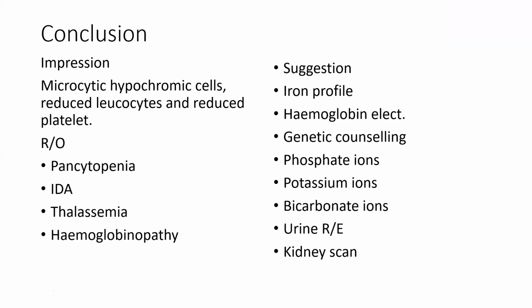Okay. Thank you. I would not love to take us back, but the question with regards to if we are to look at the parameters concerning the WBC, whether we are choosing relative or the absolute values. I usually have an approach where I look at both, and with the background knowledge that generally in the WBC differentials, the neutrophils are of the highest population, followed by the lymphocytes, then the monos, the eosinophils, and then the basophils. That being the order, even if you look at the absolutes, and there is an increase, but not beyond the reference range, it should be pointing to something.